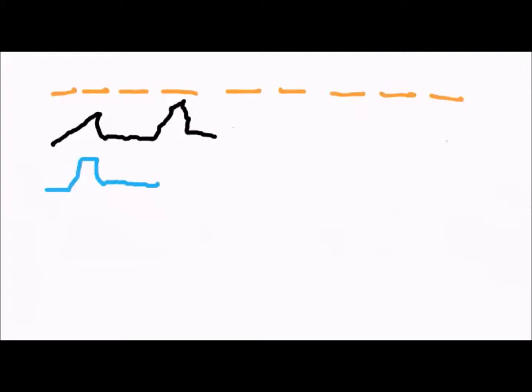What you'll notice with the flow, and I'll show this in the simulator also, is that the flow rate is staying pretty stable because I haven't hit this pressure limitation yet. It hasn't really changed my breath to a pressure controlled breath. Then you'll see a pressure limitation breath, and during this breath my flow starts to look like a pressure controlled breath, and it starts to decelerate.